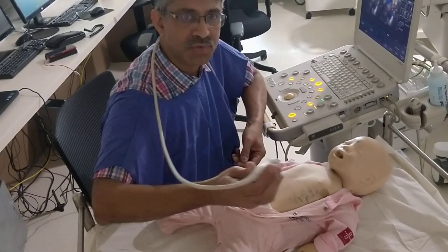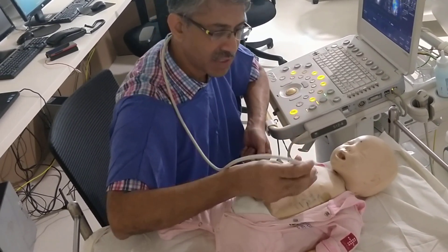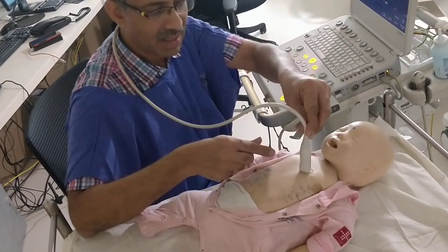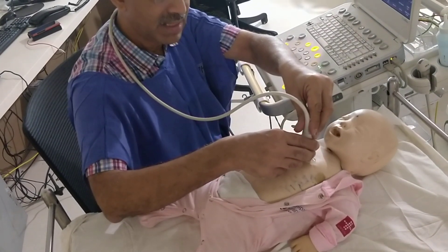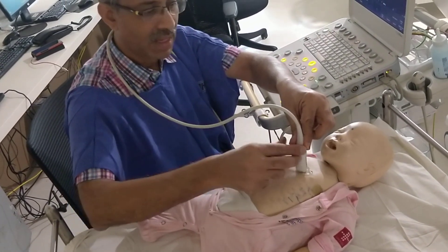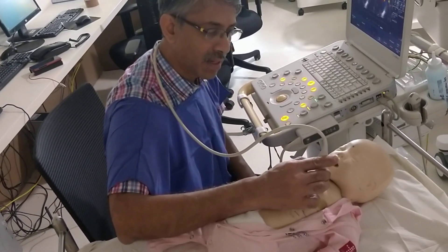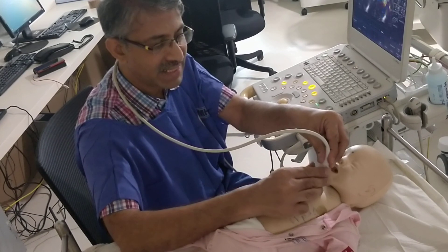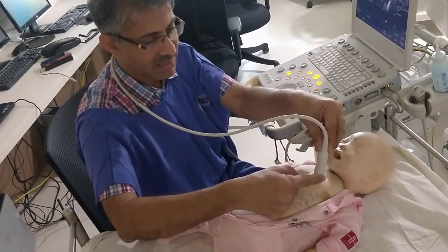There are different views used to demonstrate patent ductus arteriosus. The commonest view is the parasternal short axis view, where the probe is placed in the second intercostal space parallel to the sternum with the marker facing to the left shoulder joint. You can also use the ductal view, where you keep the marker sagittally — parasternal sagittally — to demonstrate the ductus.